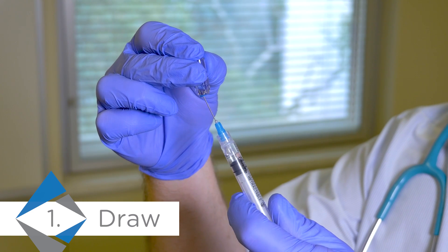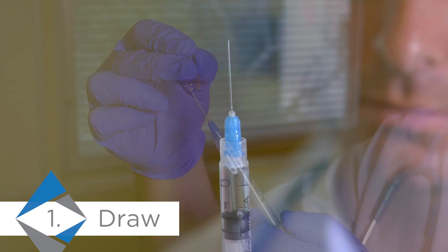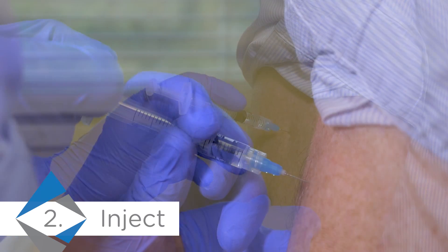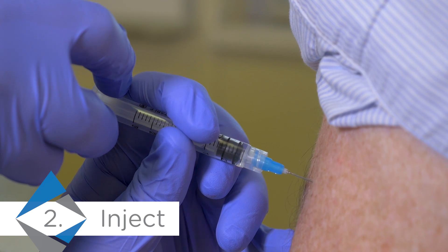Then draw out the medication using the standard aseptic technique, filling the syringe. Inject the medication, making sure to fully depress the plunger to engage the ClickZip locking mechanism. A click will be heard.